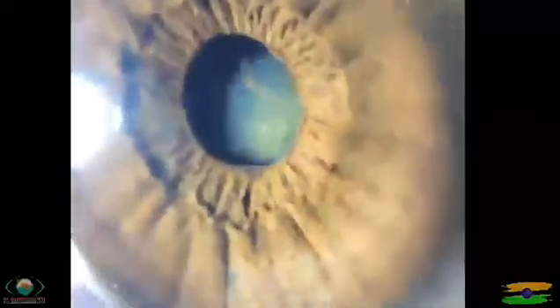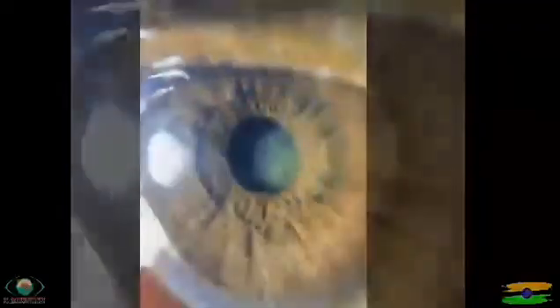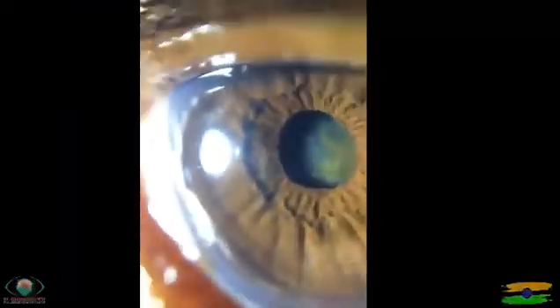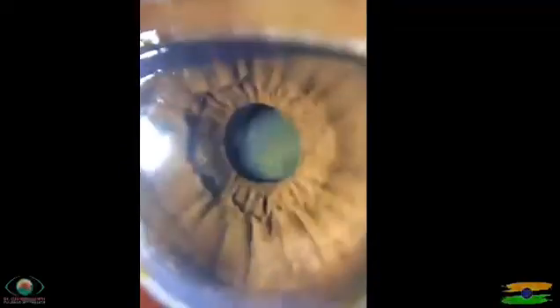Videos taken from ASPE are also demonstrated here, showing examples of anterior segment findings including pseudophakic bullous keratopathy and iris findings.